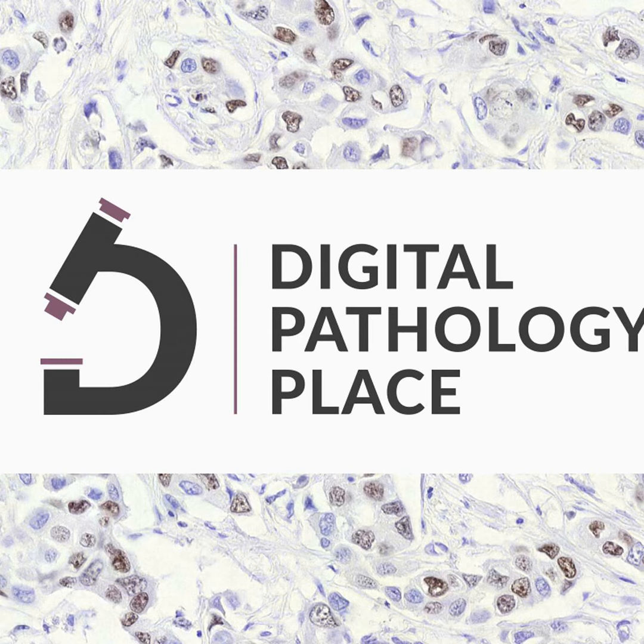And that's something that's extremely important, especially in the context of what I would consider these new deep learning paradigms, because deep learning, while on one hand it has the power to learn that a specific disease presentation is associated with a more aggressive type of disease, at the same time, deep learning has the ability to learn this slide: all of the patients that have a good prognosis have a very light slide, and all of them that have a bad prognosis have a very dark slide. So then during test time, if you give it a light slide, it's like, oh, it must be a bad prognosis, having not studied any bit about the actual disease presentation itself.